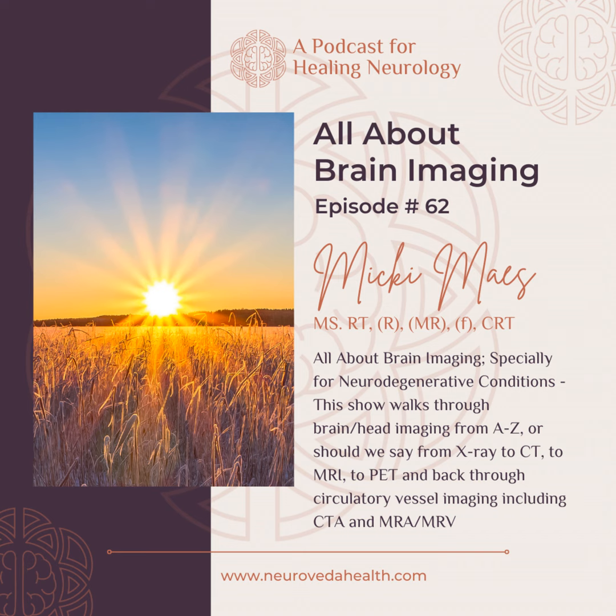And then when would we use contrast like gadolinium? So gadolinium is definitely used for various studies in MRI. Generally speaking, to do an MR angiogram or an MR venogram, you do not need contrast media. We generally will inject contrast if we're looking for post-surgical changes, so we can really identify the difference between scar tissue and some sort of new pathology, and also if we're looking for any sort of cancerous pathology. So it highlights like a Christmas tree in those instances when you use gadolinium.